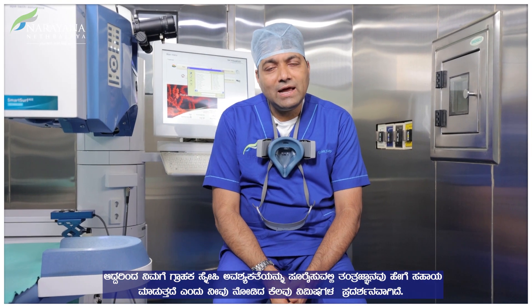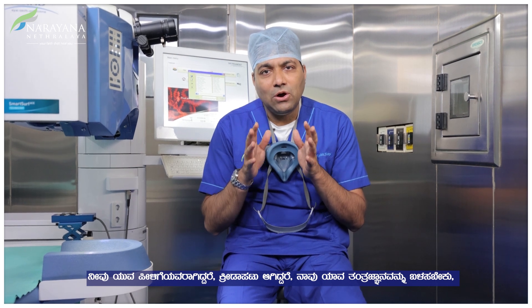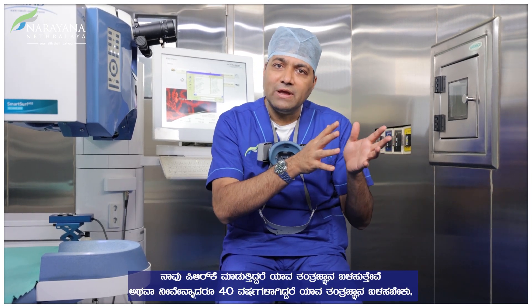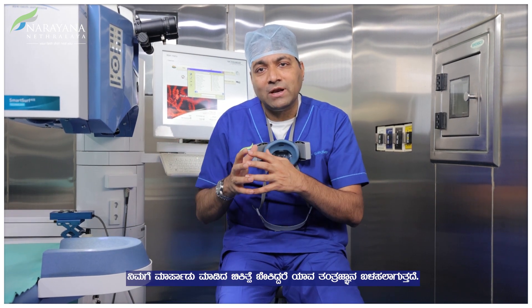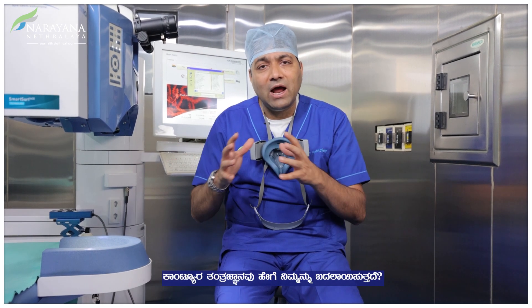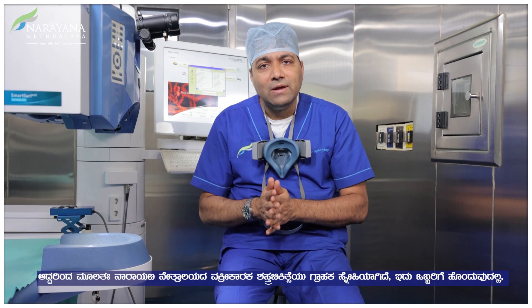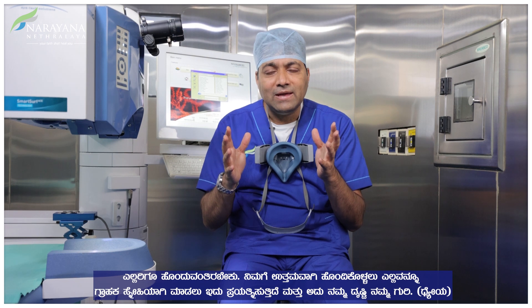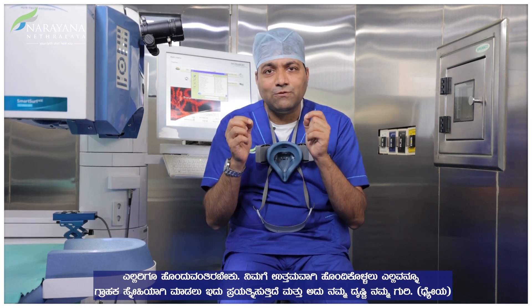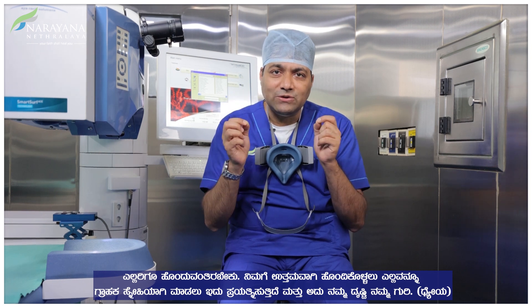What you've seen in the last few minutes is a demonstration of what technology can do for every customization necessary for you. If you are a young person or a sportsman, which technology do we use? If you are doing a PRK, if you are 40 years old, or if you need customization — what technology do we use? Narayan Netralaya's refractive surgery is all about customization. It's not about one fit fitting everybody — it's about trying to customize everything to fit you to the best. And that is our vision and that's our goal.